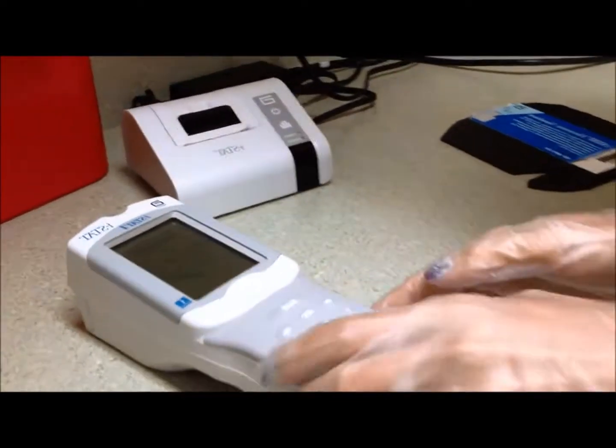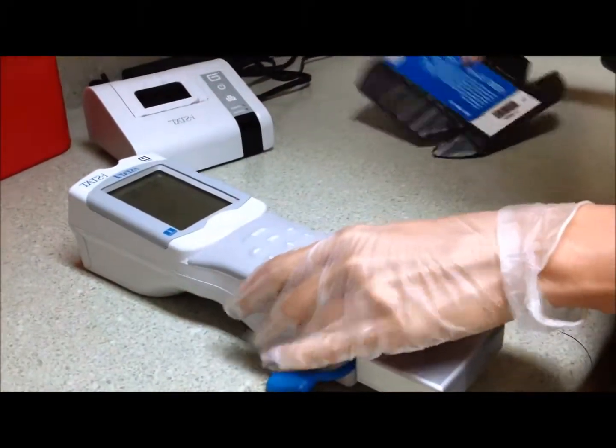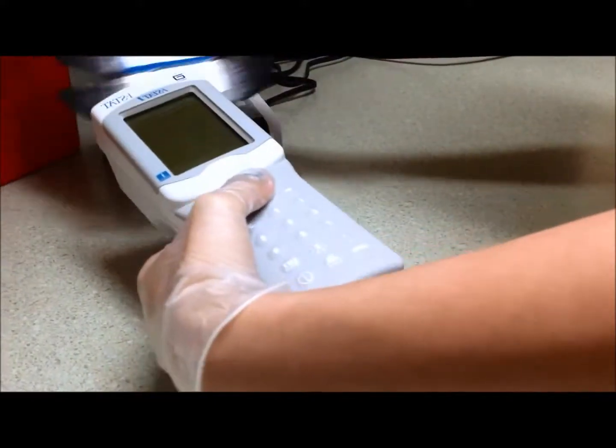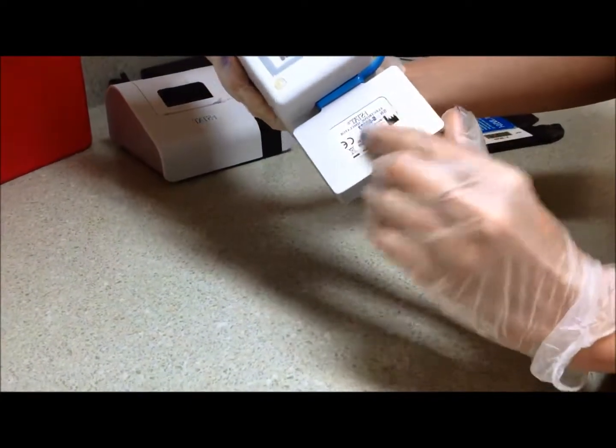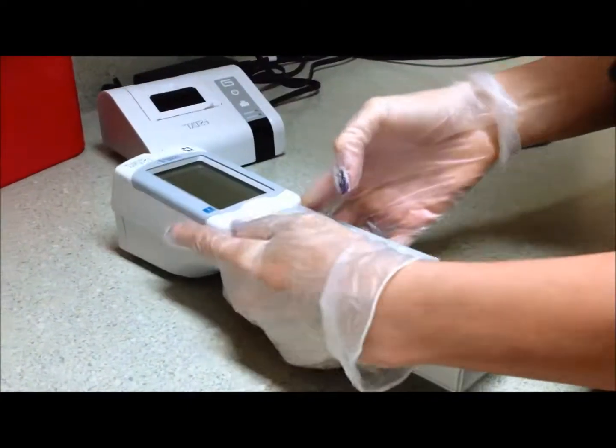You will then scan or enter the simulator ID. You can either scan the box top, or the simulator ID number can be found on the bottom of the simulator.